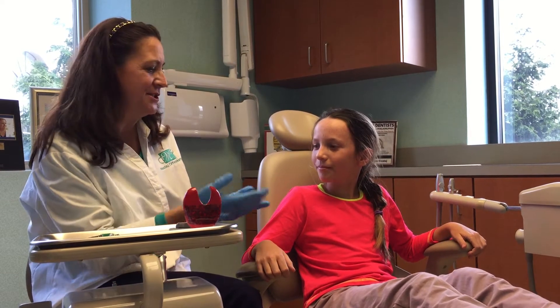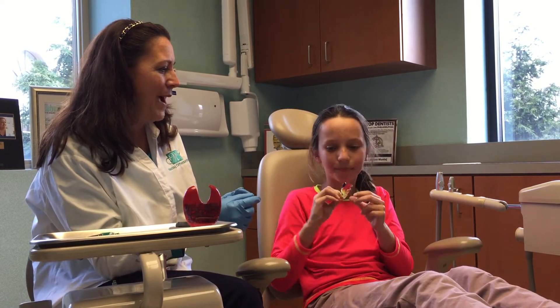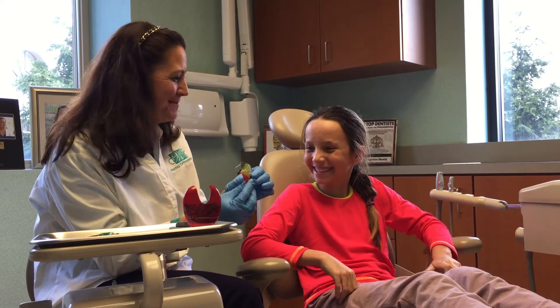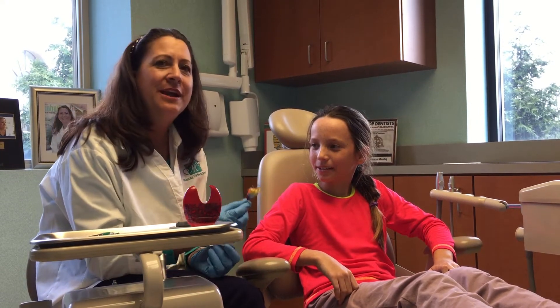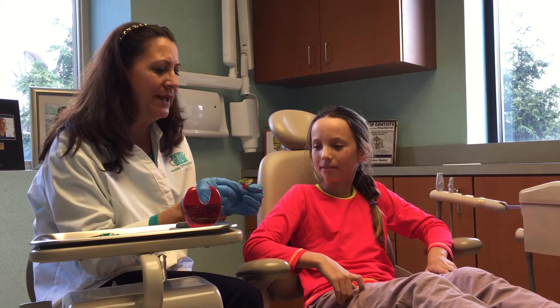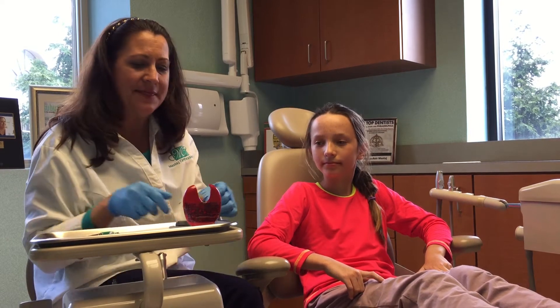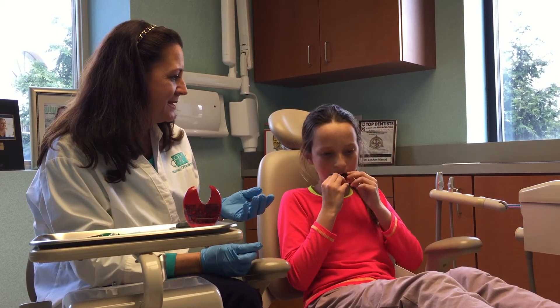Now Zoe's in a retainer, so let me see a retainer, Zoe — take it out. Wow, that's so colorful. Look, it's rainbow. That's great. Zoe comes in for retainer checks about every three months, and we adjust the retainer. She just wears this to bed at night. And on the bottom, she has a Schwartz.